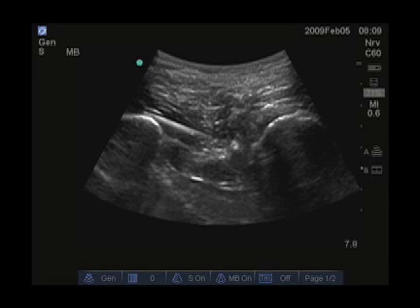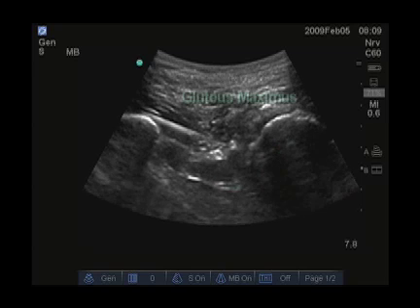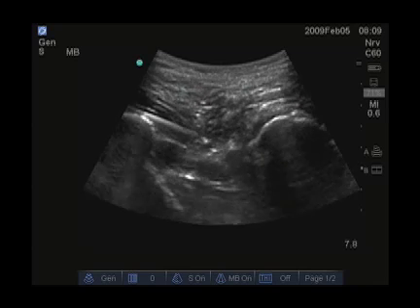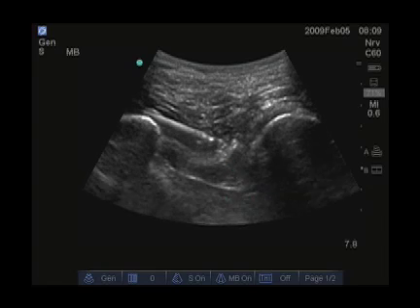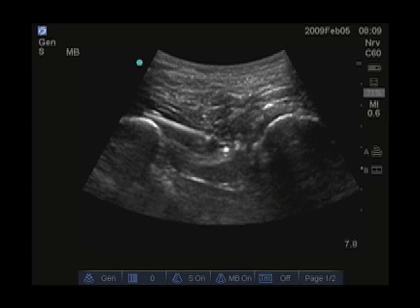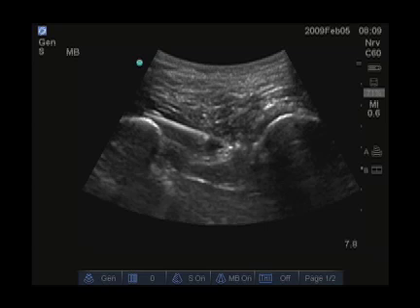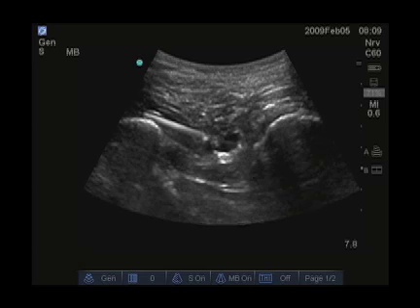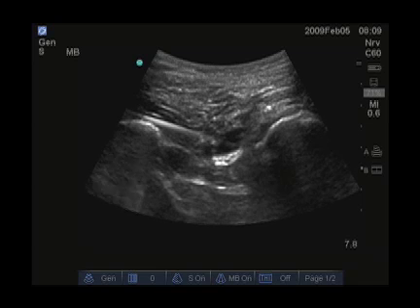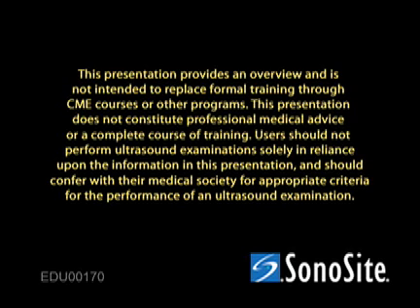Here you can see the greater trochanter on the left side of the screen and the ischial tuberosity on the right. The gluteus maximus is superficial. A 21-gauge needle is advancing to the sciatic nerve, which is below the gluteus maximus and above the quadratus femoris. The needle is advancing above the sciatic nerve to get local anesthetic to spread to the medial side of the nerve, which is more likely to reach the larger tibial component as well as the posterior femoral cutaneous nerve of the thigh. You can now see the hyperechoic nerve below the local anesthetic.